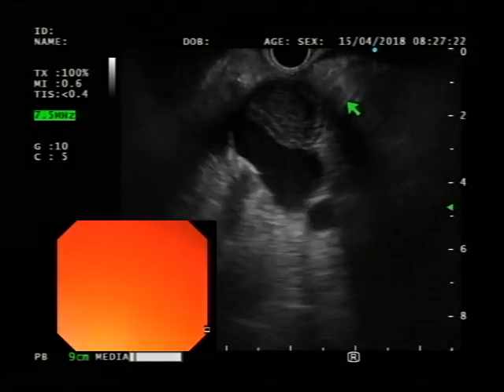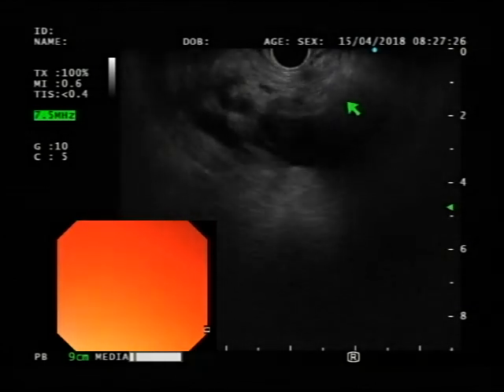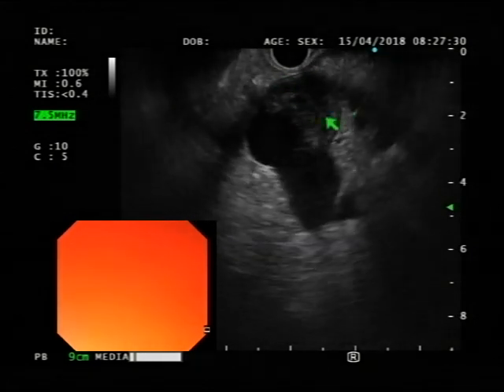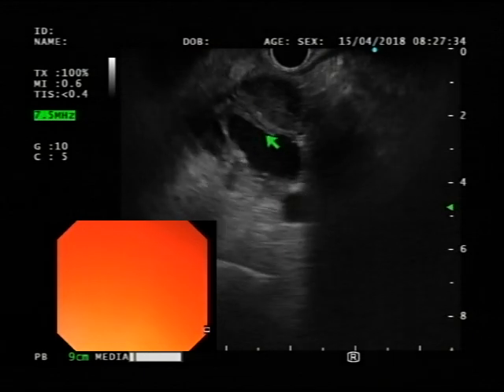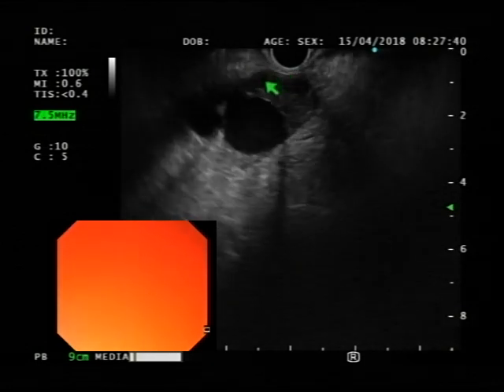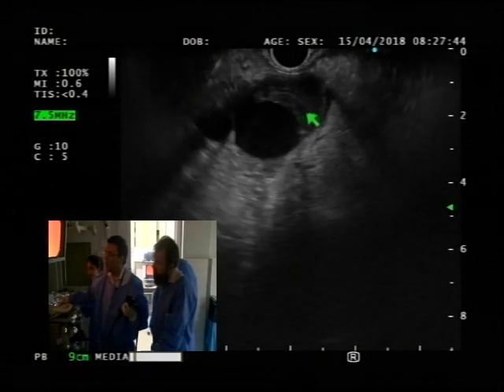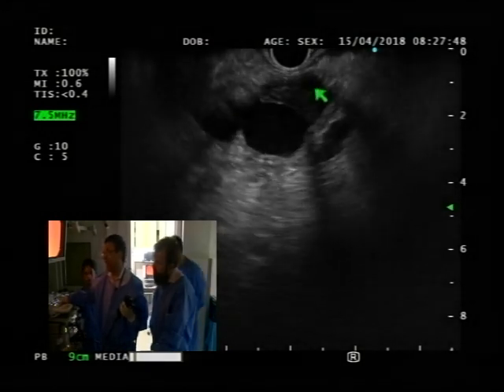It's hanging in there. When you get to this point, it gives you an idea maybe there is a mass there, but the more carefully you look at it, it's like a vessel with a clot on the side. Here you see that. If you turn it to the right, it looks like there may be a mass there, but it's the same process. I really don't see anything there.